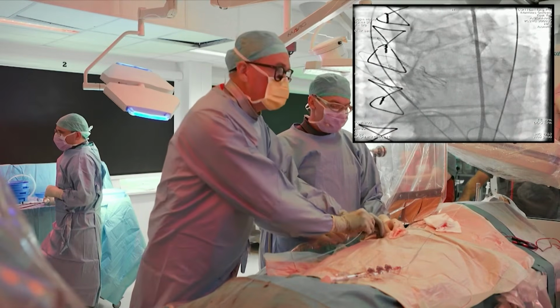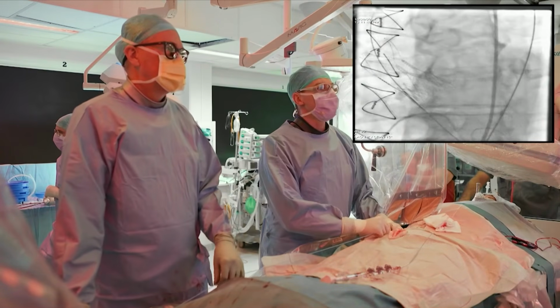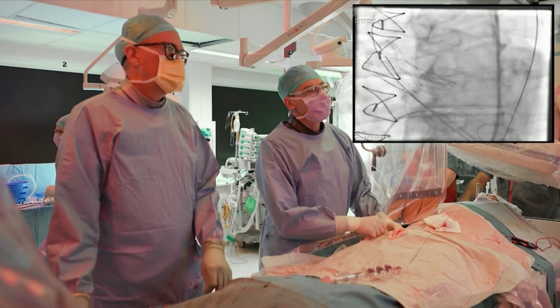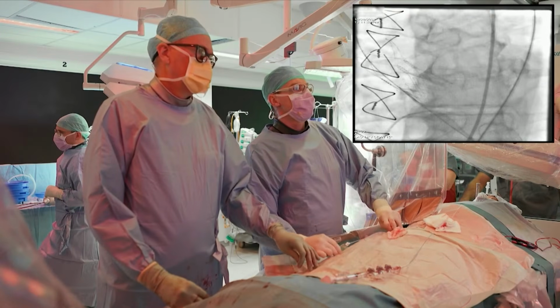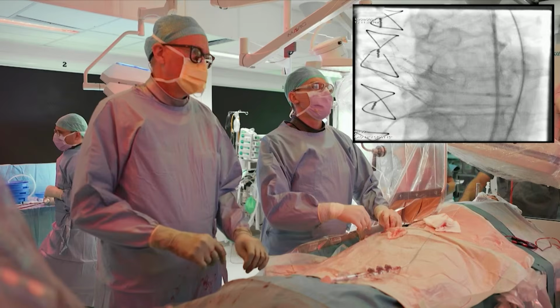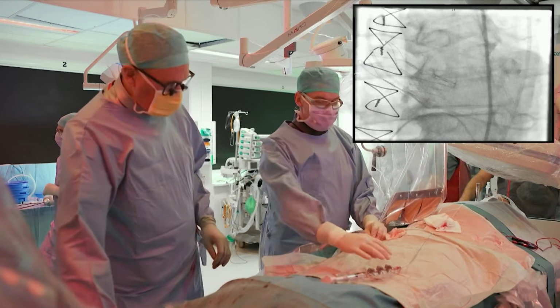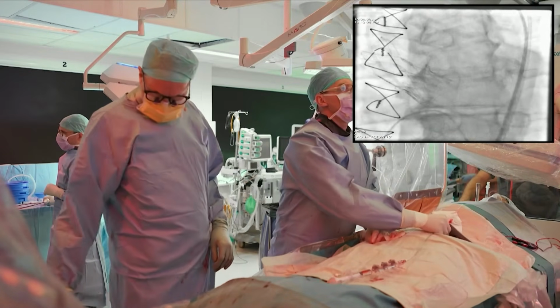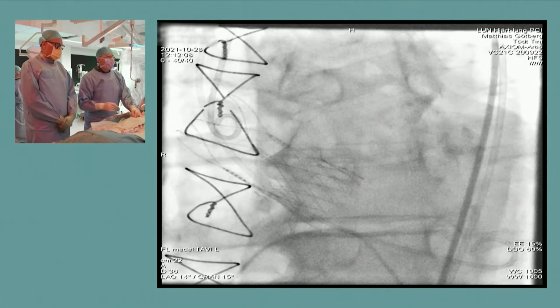Yeah, I mean, we use the cusp overlap view, as Lars mentioned as well. And we actually torque in the cusp overlap view, so we use the 3-cusp view to understand in which direction we are going to torque, but then we find it easier to torque in the cusp overlap view. I think with your experience it probably doesn't make a big difference, but maybe for beginners it's a bit easier to identify what we are exactly looking at in the cusp overlap view.